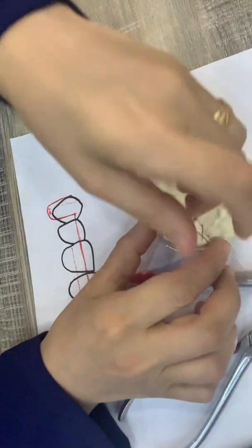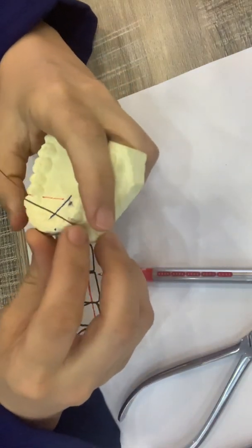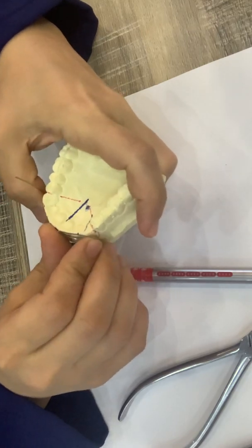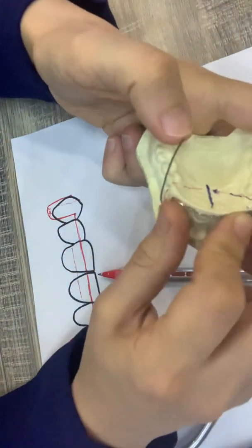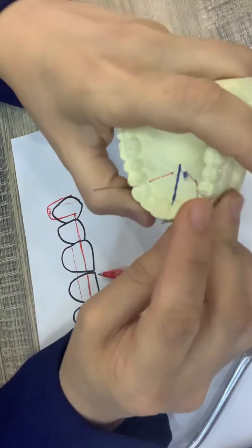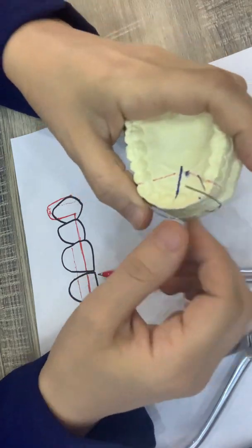Check on the cast. These two wires should be approximated to the contact area.